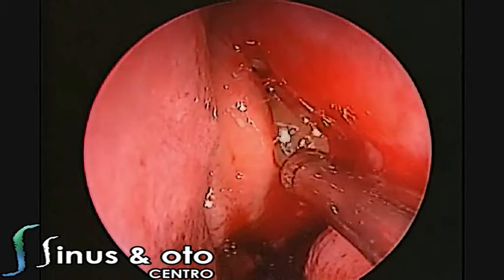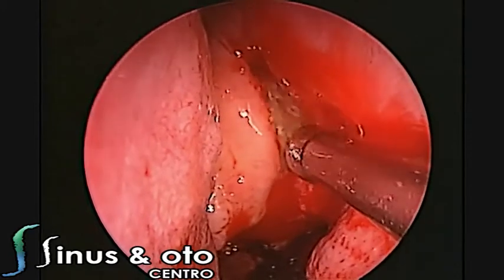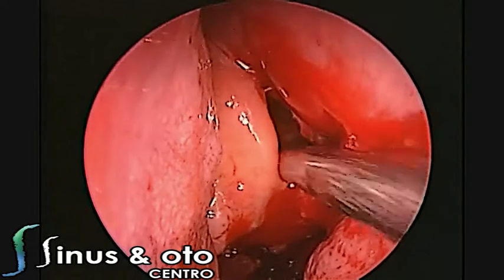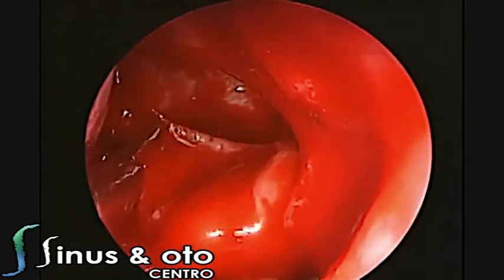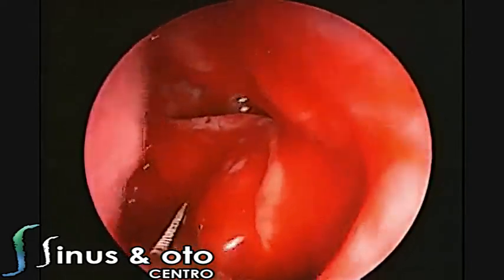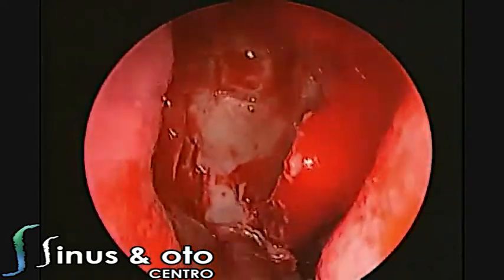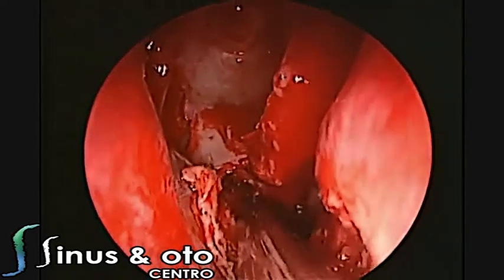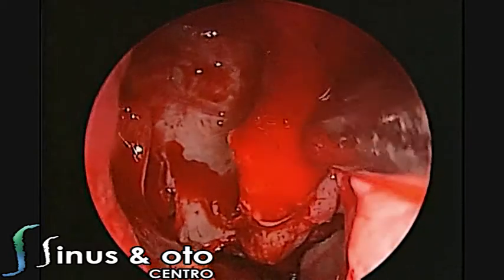Then we drain and aspirate the contents of the mucocele. We remove the remaining parts of the mucocele in order to marsupialize the lesion so that the mucocele does not reform again. We marsupialize in a very big way to ensure it does not reform.